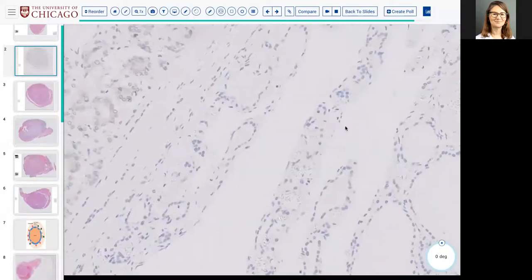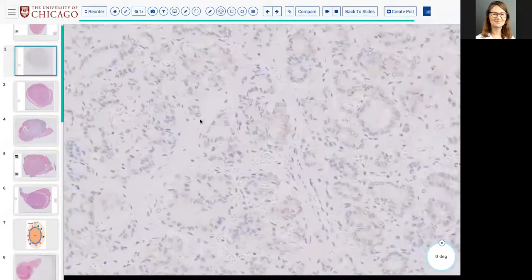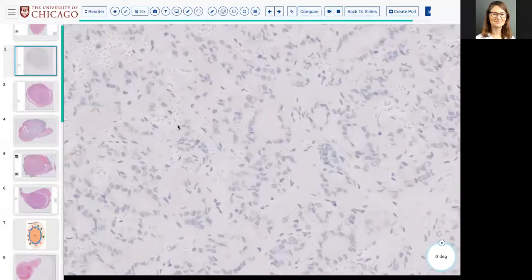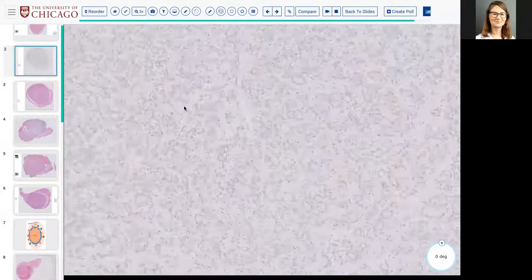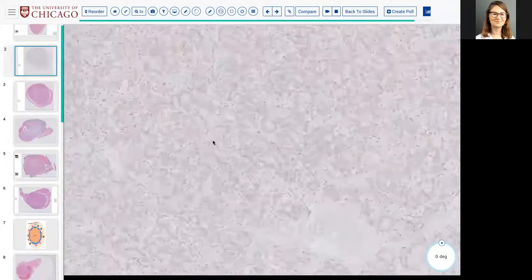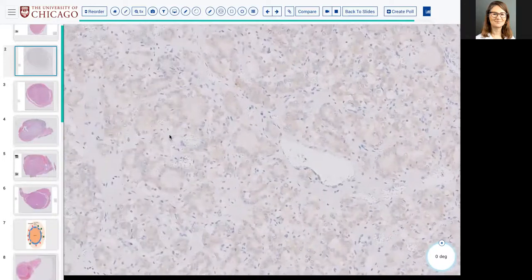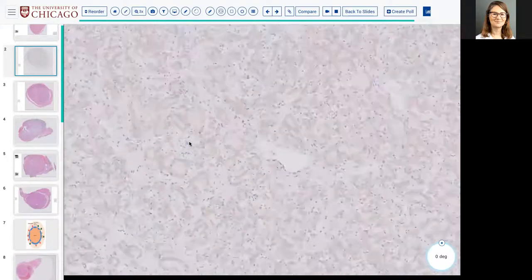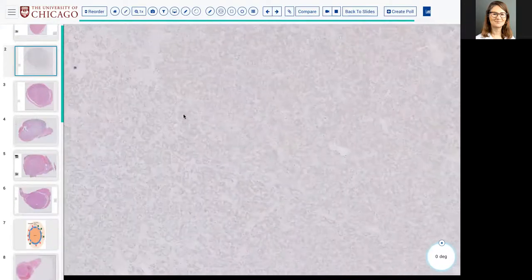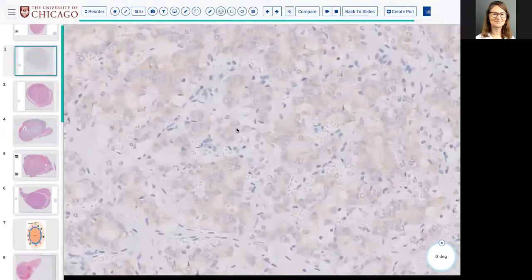So if you see any significant amount of cytoplasmic expression in the tumor, especially in this case where it's essentially diffusely present throughout the tumor, here's a nicer area. This is positive. Dr. Venkatraman is shifting the clones from a pre-dilute to a dilution, since whatever this clone is works better in the hematologic things.